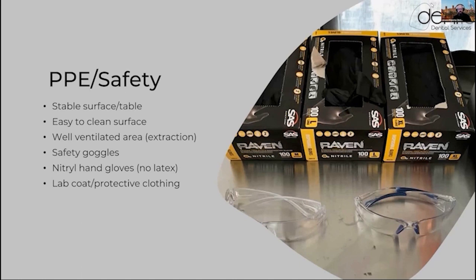And I walk to that table and the table is just moving. Yeah, of course, it's not a stable print. So work on a stable surface. Also work on an easy to clean surface. For example, all my printers are on stainless steel. So well ventilated area. We need to have safety goggles, nitrile hand gloves, and use a lab coat.